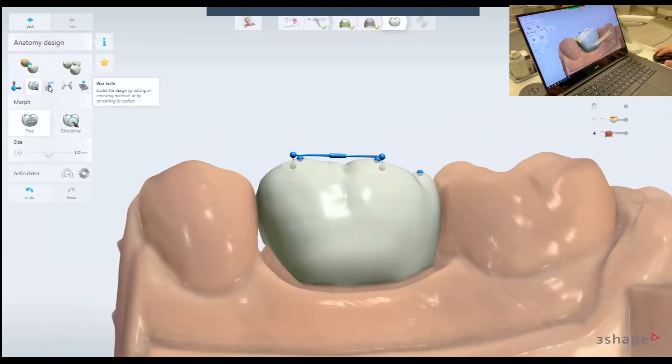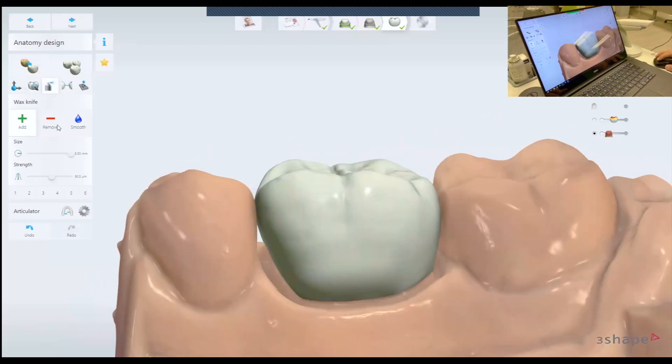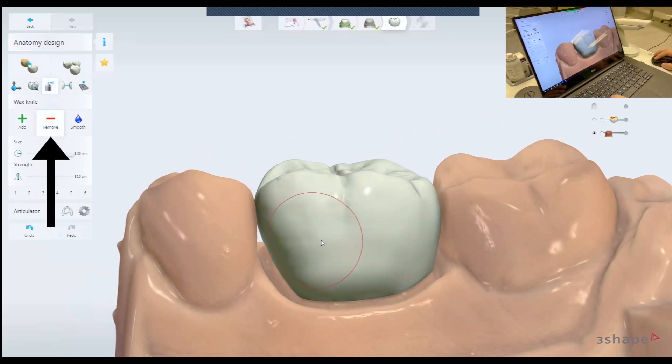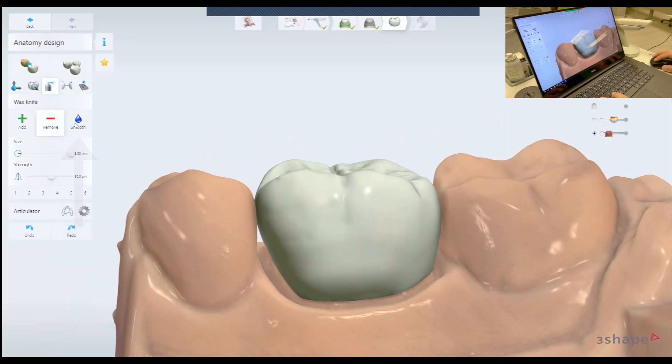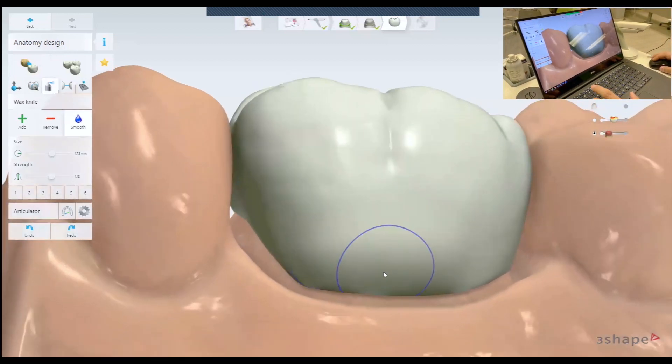The next tool is the wax knife. The wax knife is a sculpting tool. There is the add feature, there is the remove, and there is the smooth. Usually I would use the smooth to smoothen the contours here.